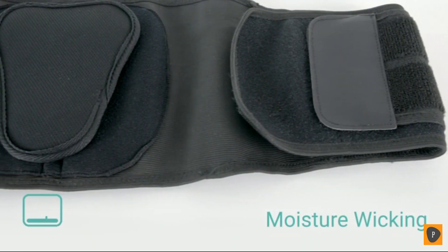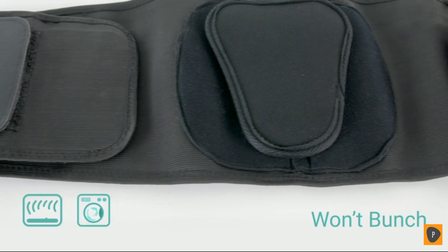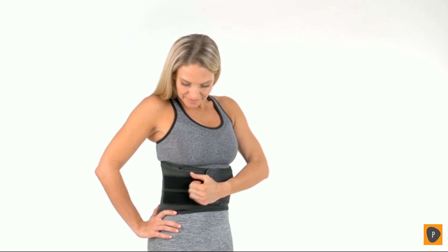Breathable, lightweight neoprene wicks away moisture, doesn't bunch, and is machine washable for added convenience. Let the Back Brace by Vive provide you with the targeted compression support you need.